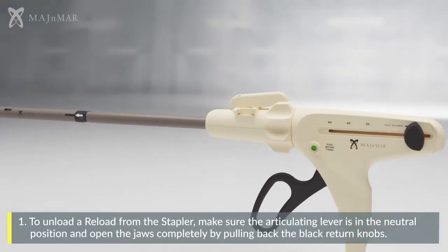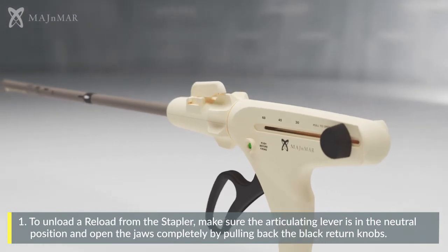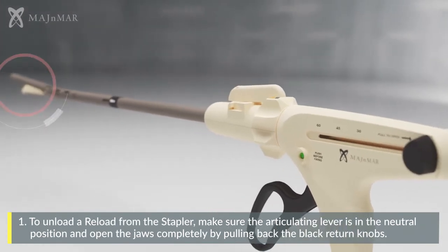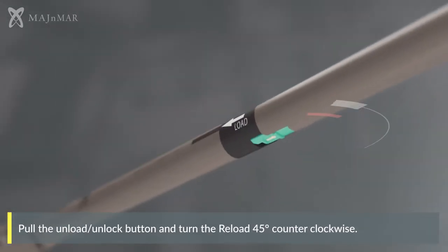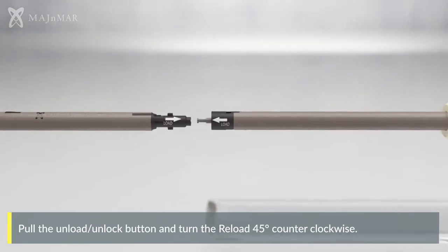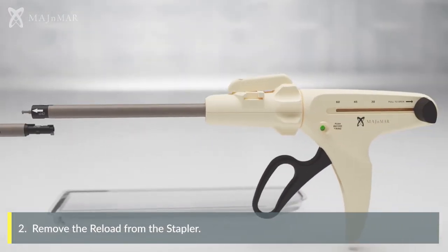To unload the reload from the stapler, make sure the articulating lever is in the neutral position and open the jaws completely by pulling back the black return knobs. Pull the unload/unlock button and turn the reload 45 degrees counterclockwise, then remove the reload from the stapler.